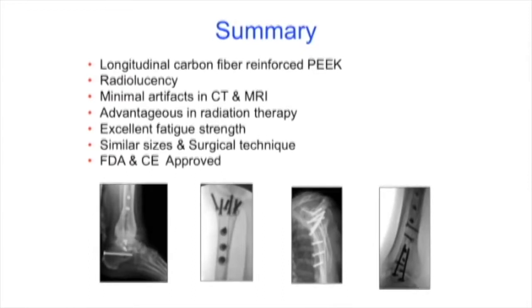Yeah. And the reason why I went for all locking screws, and John astutely pointed it out, was simply because in our use of distal femoral plates, we found that the contour always dictates where the fracture goes. So if you put a non-locking screw in there, it tends to put it into that golf club varus deformity that we typically see. So a lot of times my response has been, okay, I'm just going to line up the fracture where I need to line up and put the plate in there. If I could put a non-locking screw in there, get the plate to sit where it needs to sit and the bone to sit where it needs to sit, I will be okay. Nine times out of ten, though, it doesn't do that.